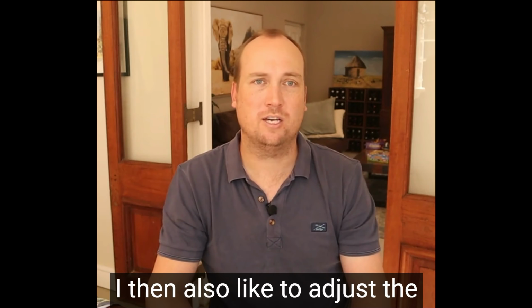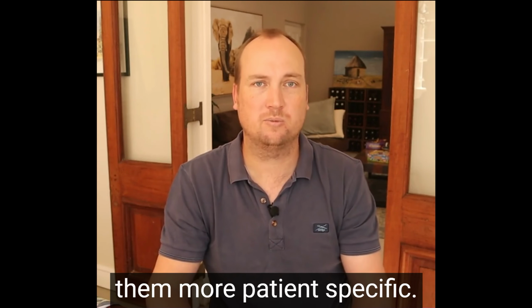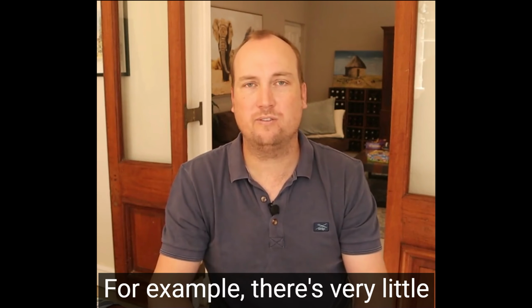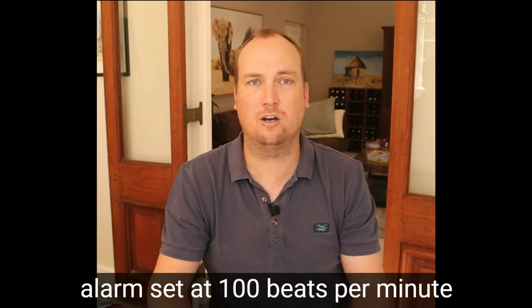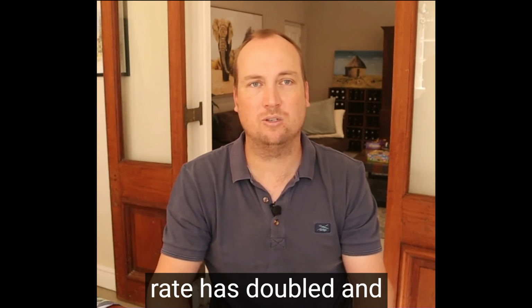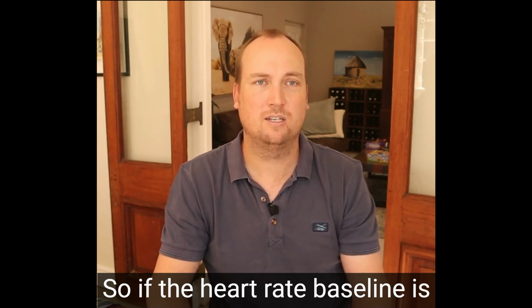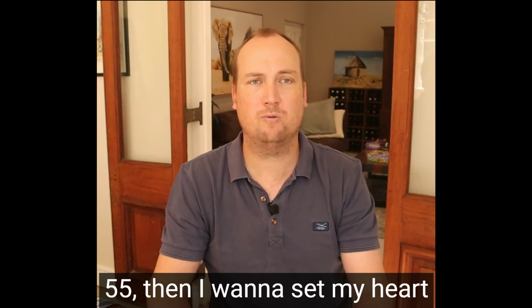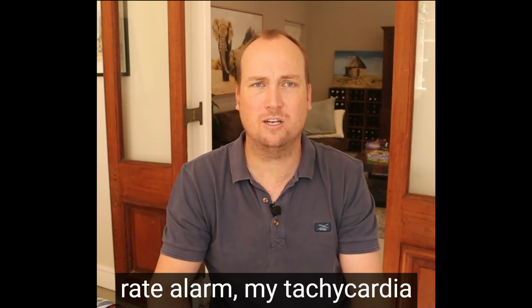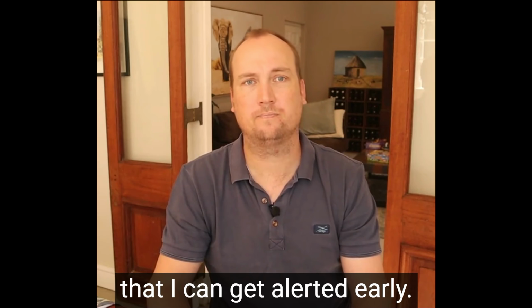I then also like to adjust the alarm parameters for each patient to try and make them more patient-specific. For example, there's very little value in having a tachycardia alarm set at 100 beats per minute for an 85-year-old patient who has a starting heart rate of 55. By that point, the heart rate has doubled and it's near the maximum heart rate for that patient. So if the heart rate baseline is 55, then I want to set my tachycardia alarm at 75 or at 80 so that I can get alerted early.